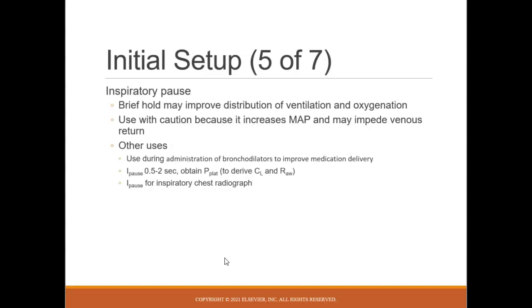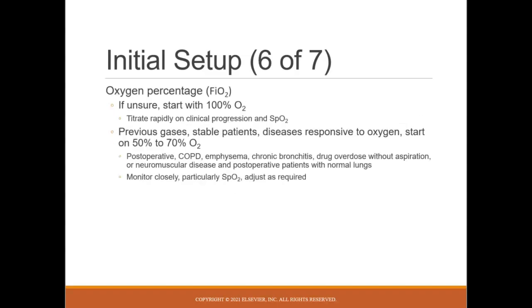The other reason that you might want to do it is we do it purposely to obtain plateau pressures, right? To get the numbers necessary to calculate compliance and airway resistance. But the only other reason you potentially would want to do an inspiratory pause is when they come in to do their chest x-rays in the morning, you might want to do an inspiratory hold so that they can get the x-ray at peak inspiration so that the lungs don't look underinflated.